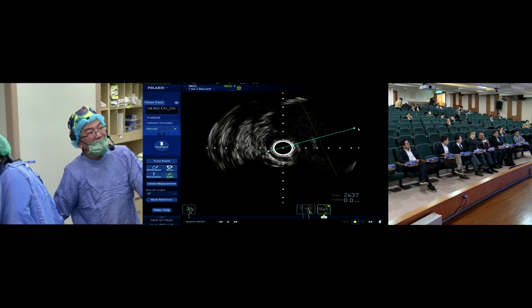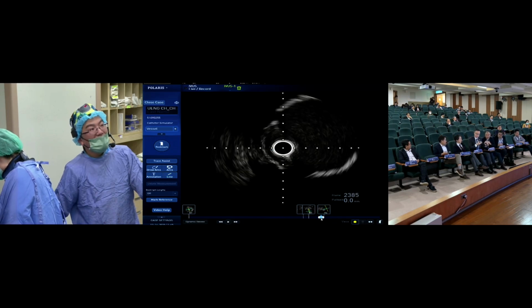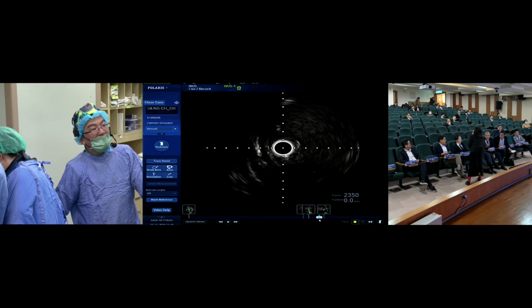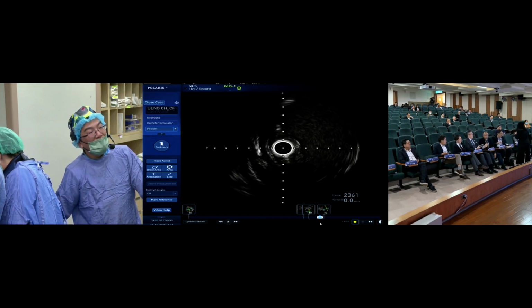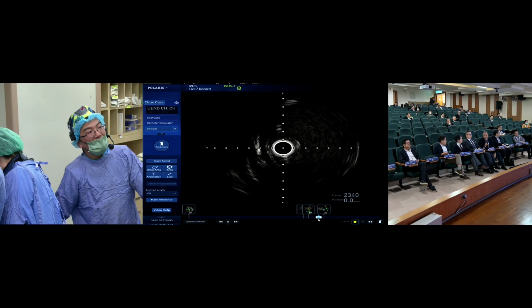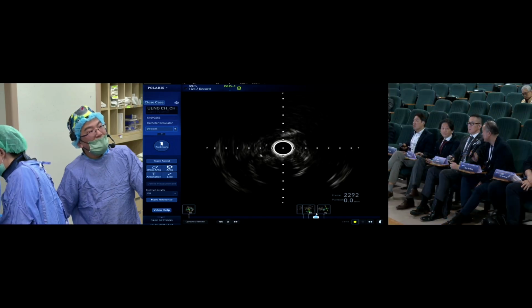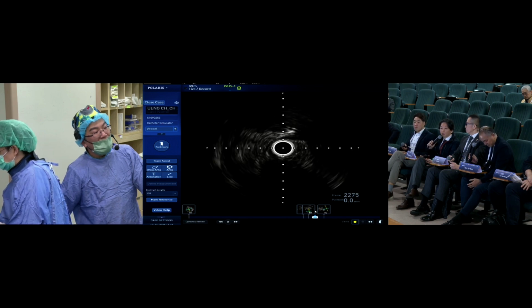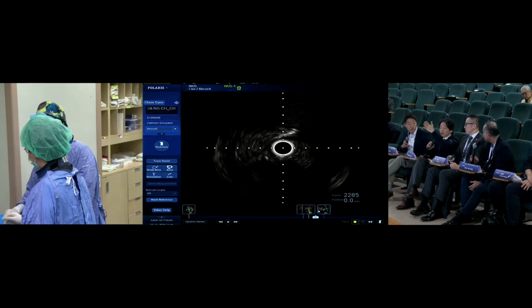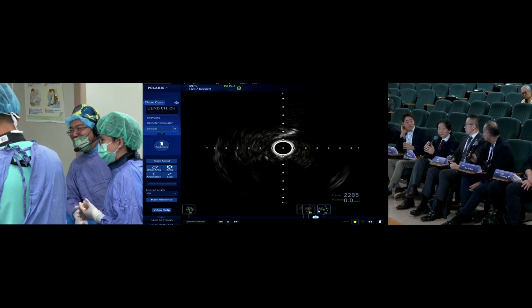Any thoughts? Can I just ask, is there any thoughts about using a thrombectomy device or an atherectomy device in a CTO, a long CTO flush occlusion here? Because your patency rates are going to be quite small if you're not going to stent here at the proximal region. But the guide wire is passing the subintimal. Yeah, but maybe the profile of the atherectomy device does not work so well.